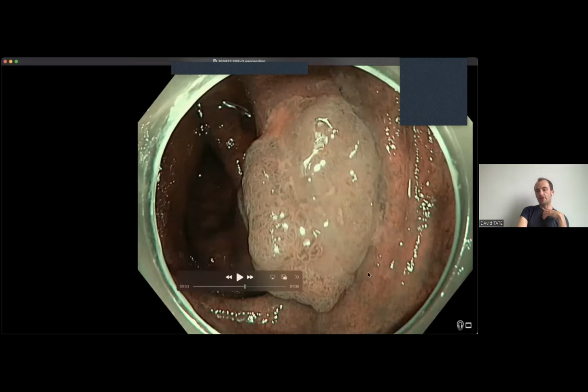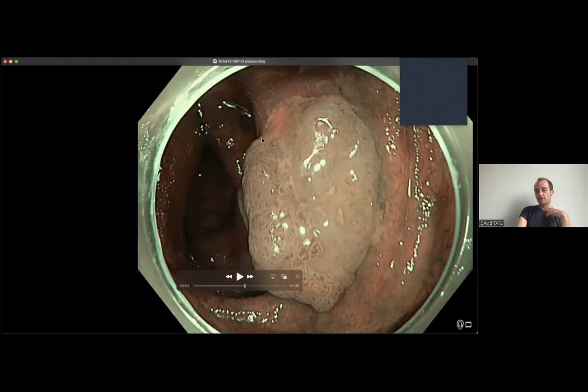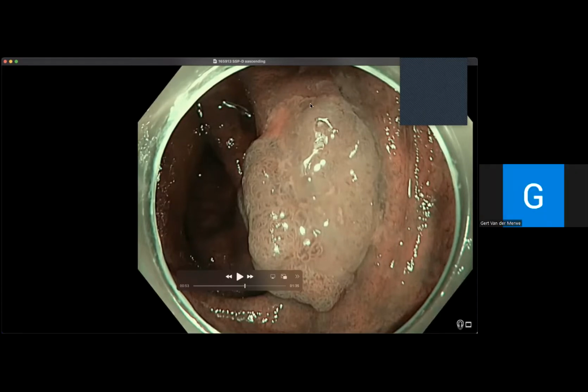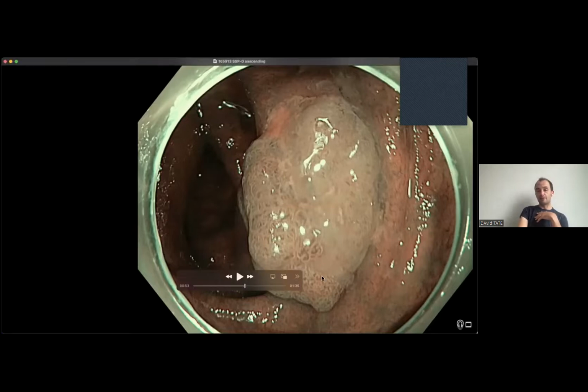Okay, so I agree with that part of what you said, but unfortunately, this polyp is a bit of a hybrid polyp. So there are two areas within this polyp. As you said, there's clearly a demarcation zone here on the right versus on the left. The left side is clearly a standard-looking polyp, right? It's very nicely structured. It's clearly regular. But the problem is the right side. At the right side, there is a serrated polyp attached to a standard polyp. So this is not cancer. This is a demarcated zone with a serrated polyp in it.